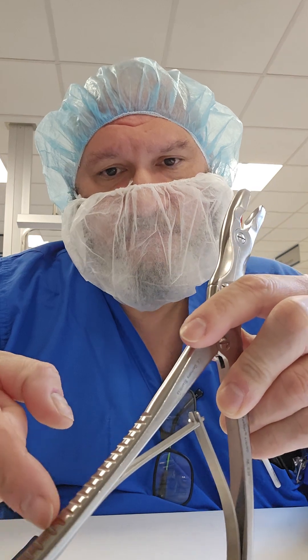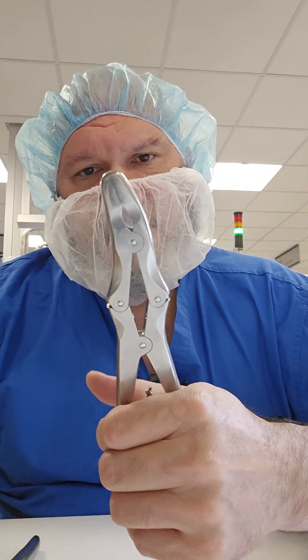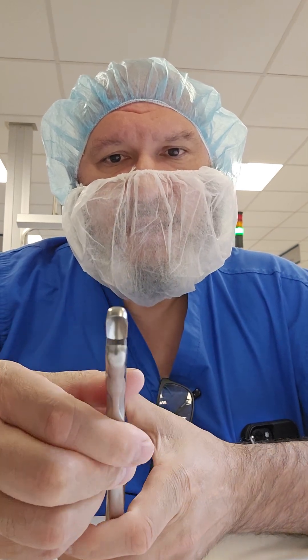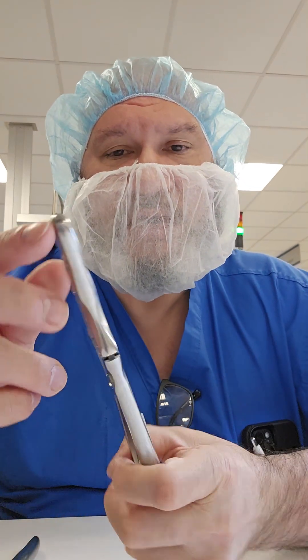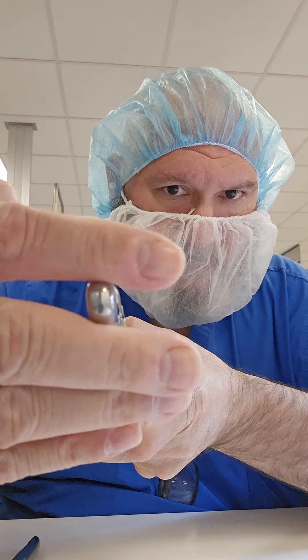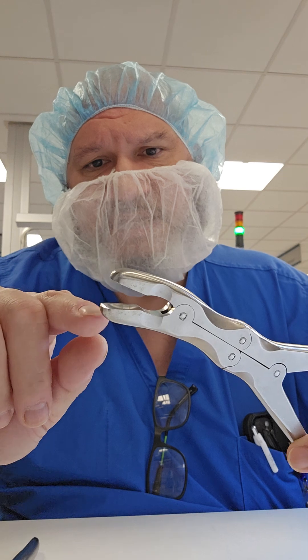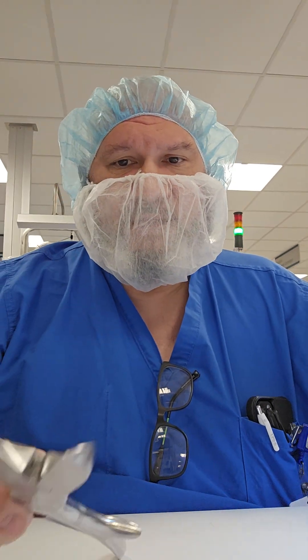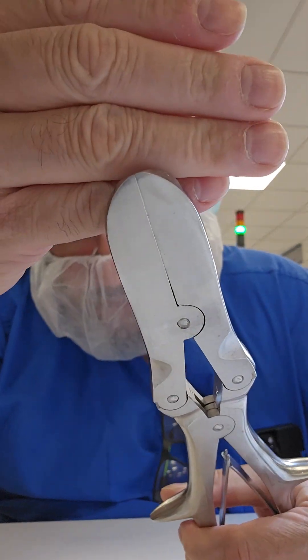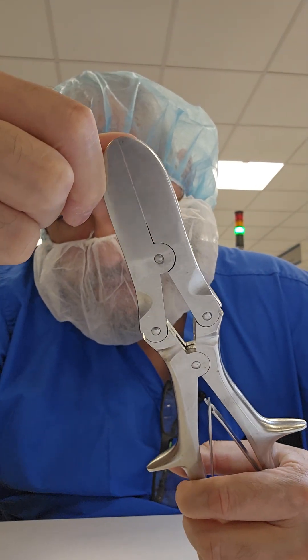Check in between each ridge on the handles for any bioburden. Make sure the instrument doesn't stick, and lubricate if needed. When inspecting, close the jaw and make sure it is not misaligned — look at it head-on to confirm a perfectly aligned, secure jaw with no gaps or indentations. For the Liston bone cutter, close the blade and look at the distal tip to make sure there's no gap all the way through.